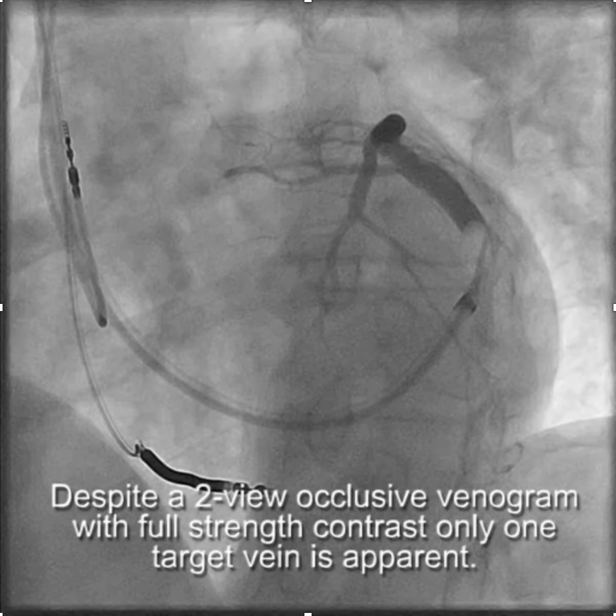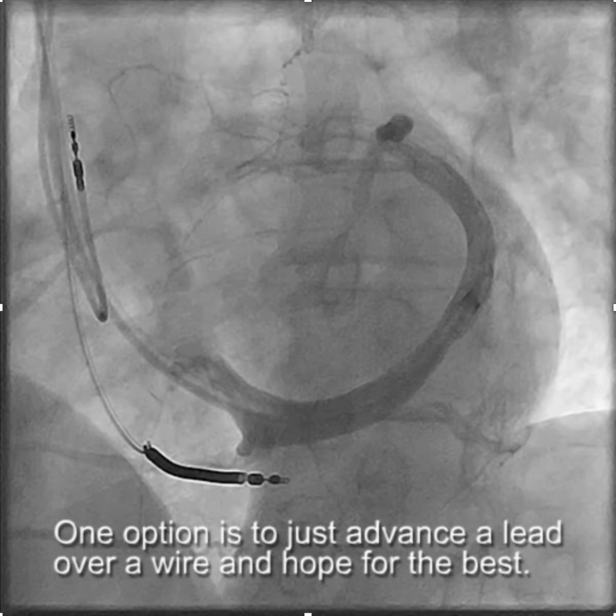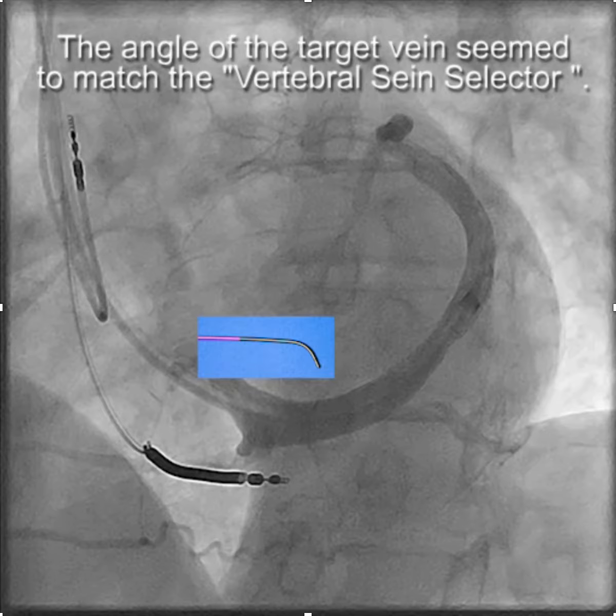Despite two-view occlusive CS venograms with full-strength contrast, there was really only one apparent target vein. So rather than just throwing a lead in, we decided to use the telescoping delivery system and choose the vein selector to try to match the angle of the takeoff of the vein.